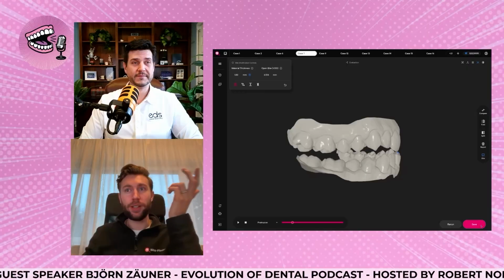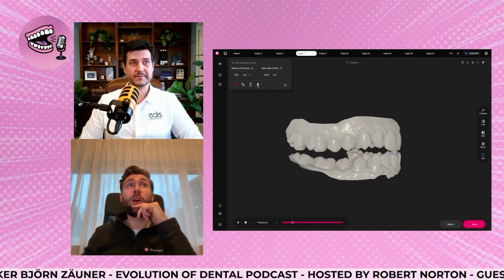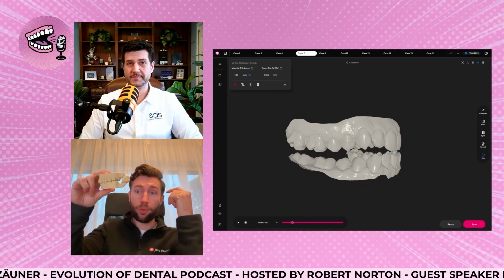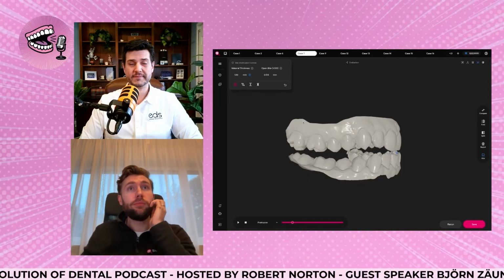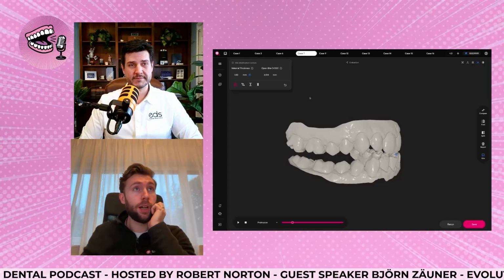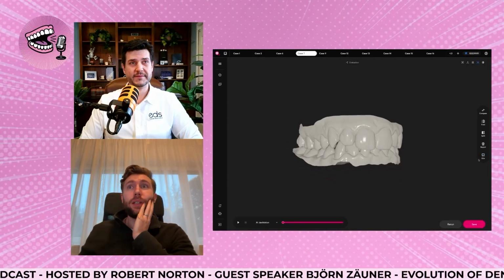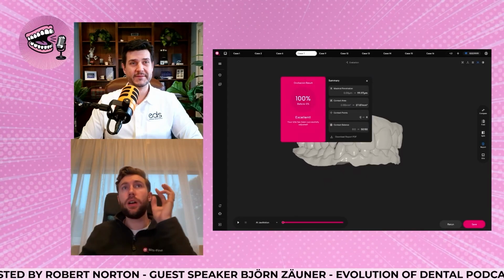Open it and save it in that position, do your design. That's it. You can now, for example, click the X icon to generate the xSNAP also in the open position, which is also cool when you would need it. But I think in most cases, I would say do the splint and skip the model. So that's beautiful, new.